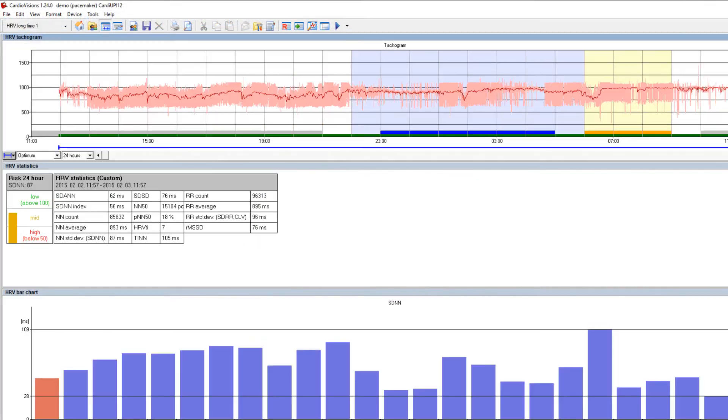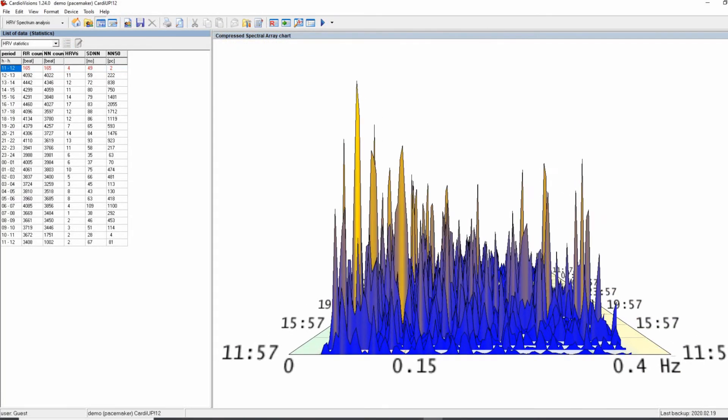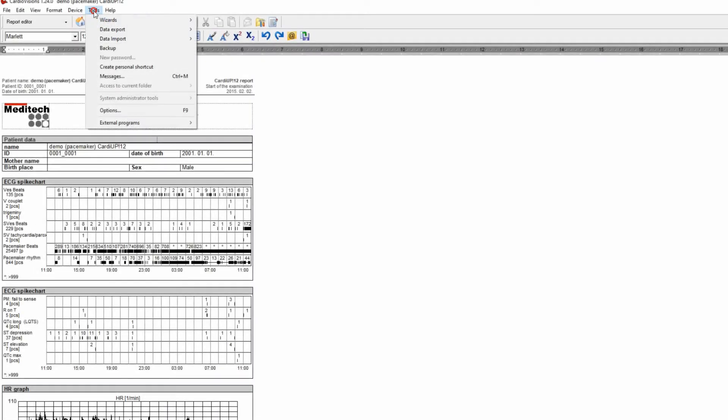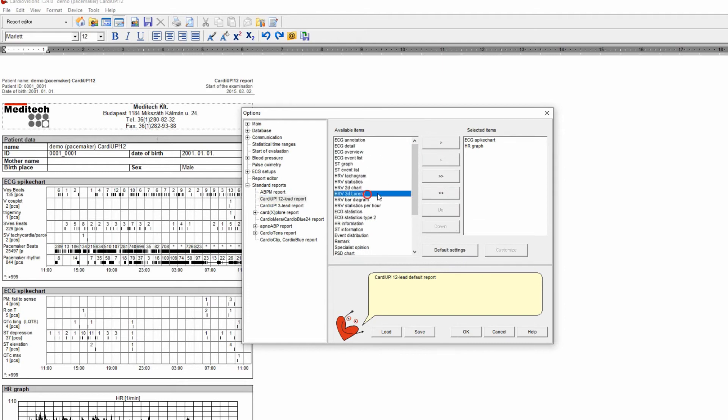For those who prefer to dive deep into data, numerous diagrams, histograms, rhythm and ECG events analyses are available. All the data can be presented at the end of the process due to the multiple options for report configuration.